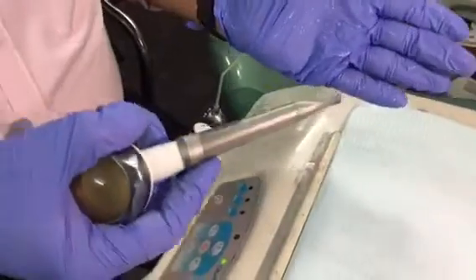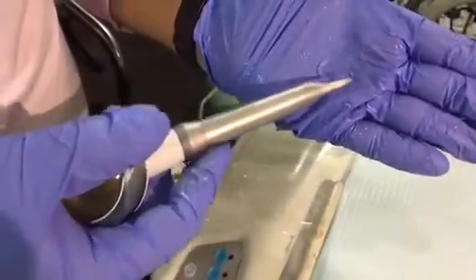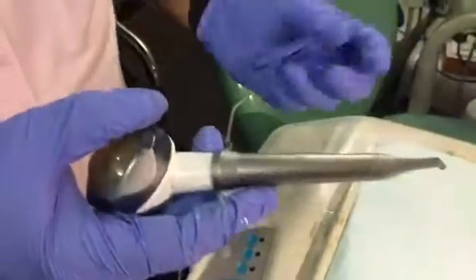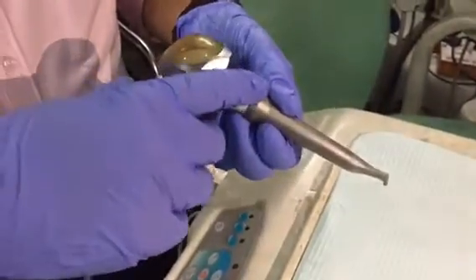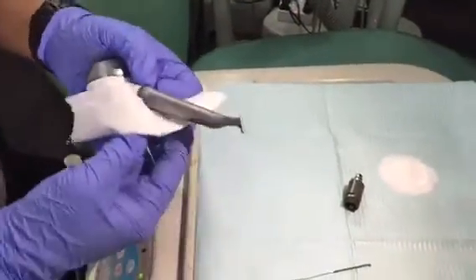If you want to double check, you can attach the head of the air rotor, the head of the handpiece, and then check. Water should come out from here also. This shows that neither the handpiece nor the head is blocked.